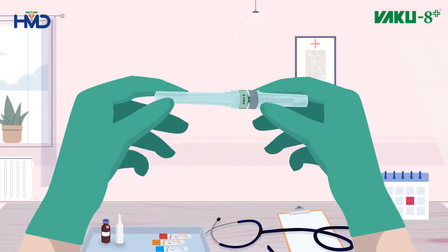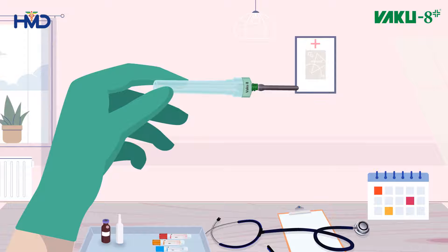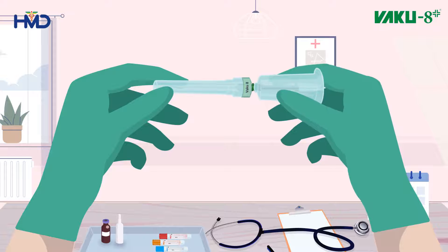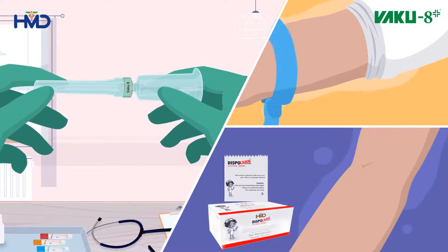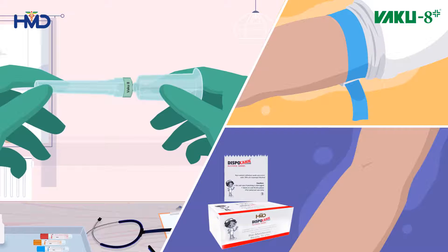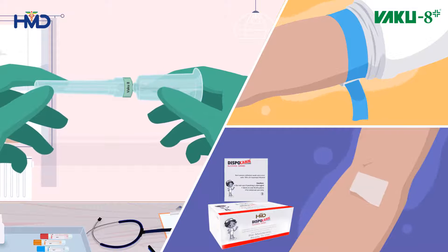To use the Vaku 8 blood collection system, start by uncapping the multi-draw needle from the shorter end and screw it into the holder. Inspect the target area and place a tourniquet above the site where you perform venipuncture. Cleanse the selected injection site with an alcohol swab and allow it to dry.